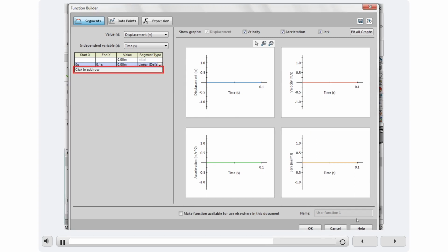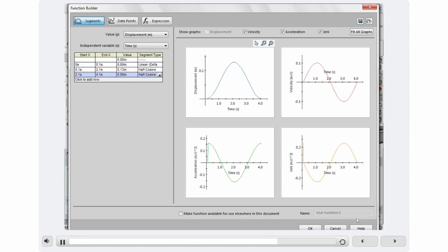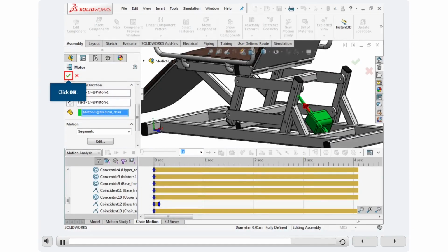Similarly, add a second and a third row. For the first 0.1 seconds, the motor does not move. It then takes 2 seconds to move the motor up to 0.13 meters and finally 2 seconds to move down. Close the Function Builder dialog. Click OK to save the definition of the motor.